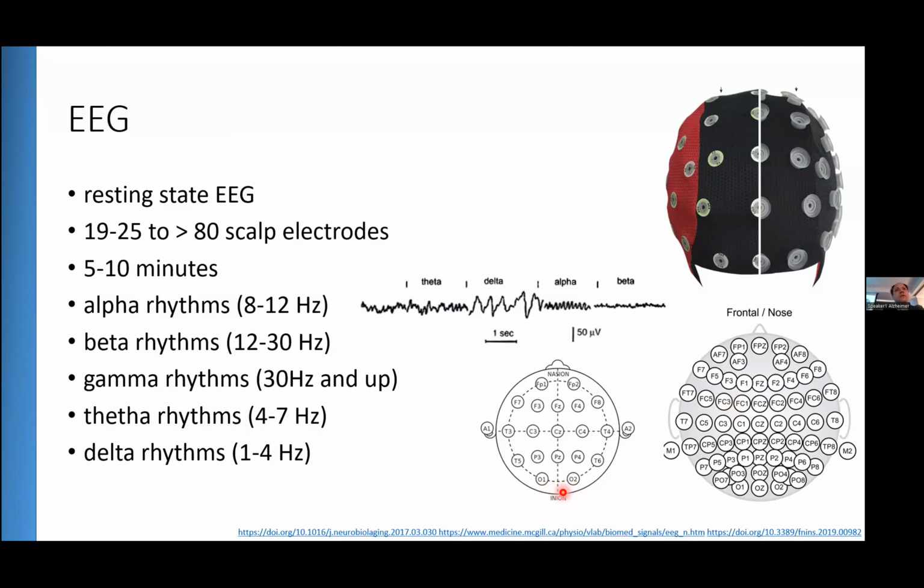Unfortunately, there is the theoretical possibility that the current is floating around the brain, and it could be recorded in the frontal lobe, in the frontal electrodes. Therefore, we need more electrodes, and when we record from more electrodes, we see the same event from different angles. We can see even the shift in the wave with the shift in the source, and then we can say, yes, it is highly probable that the activity is in this part of the brain. Or we use different techniques, on which I will talk a bit more later.